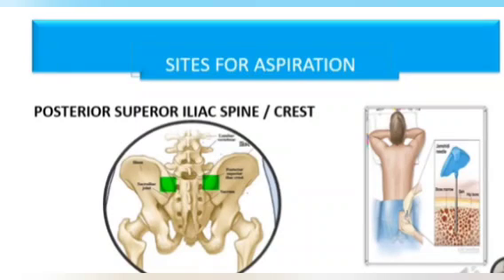Bone marrow trephine biopsy can also be performed from the same site with the same skin puncture. We can take both at one time.